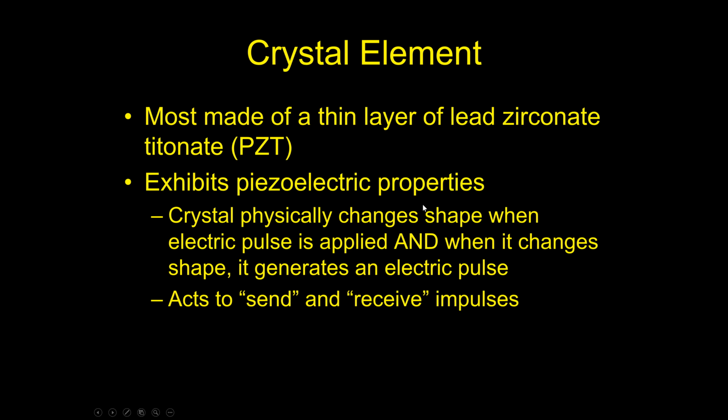Something that exhibits piezoelectric properties, again, it's a transducer, is such that if I press on it with my finger or anything else, it converts that pressure energy into electric energy. And the opposite is also true: if I shot electric energy into the crystal, instead of indenting, it would change shape in response to that electric energy. So that's something that has piezoelectric properties.